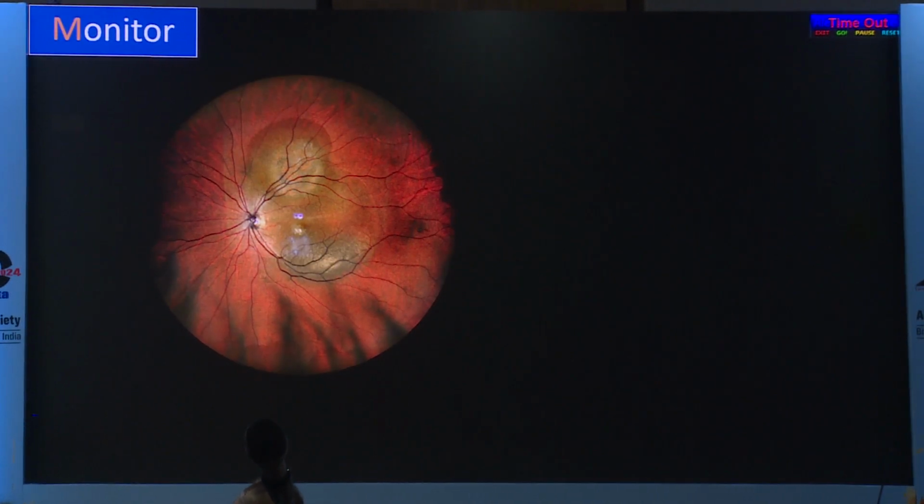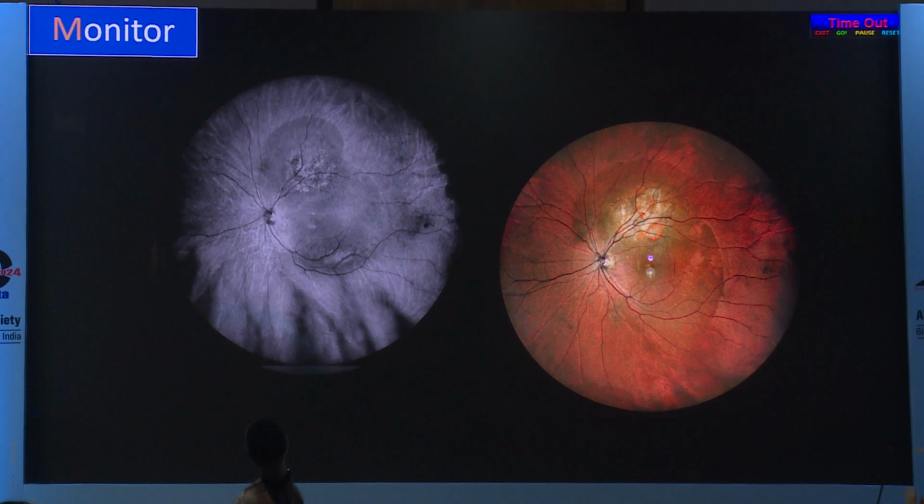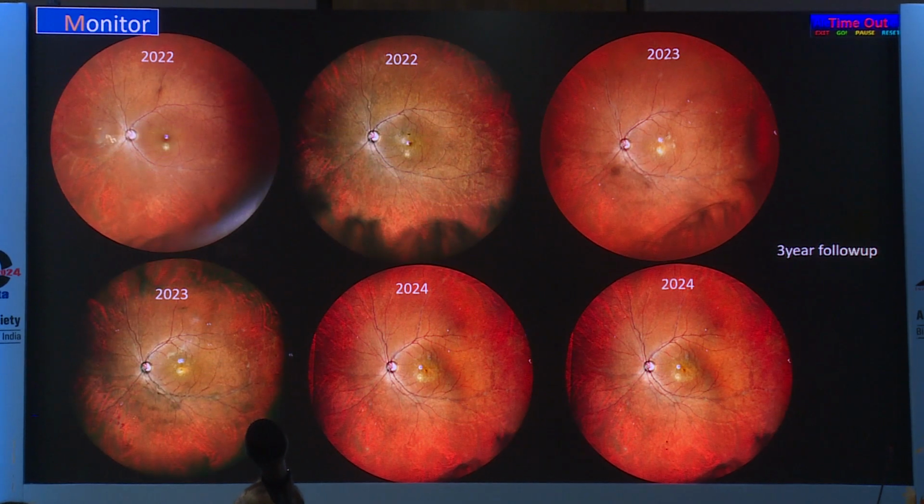Peripheral retinal tumors, an excellent tool to monitor progression and regression following therapy. This secondary had a good resolution following chemotherapy. Vasculitis monitoring again is extremely important. This gentleman I followed up for almost 3 years. He was an oncologist by profession.